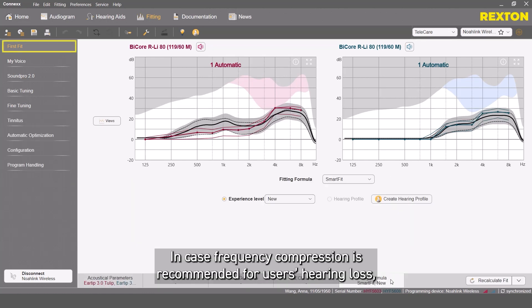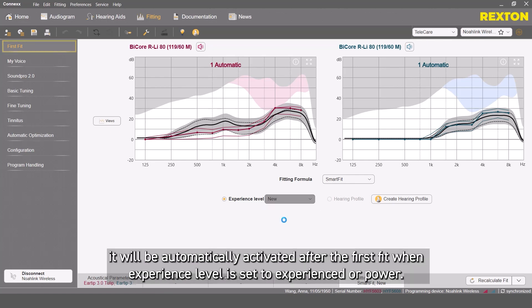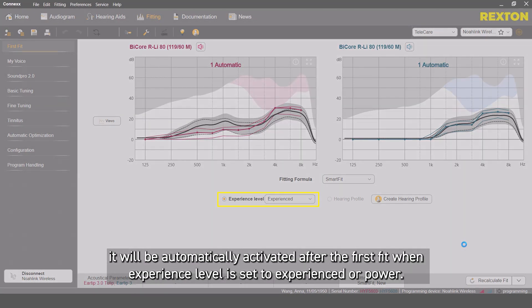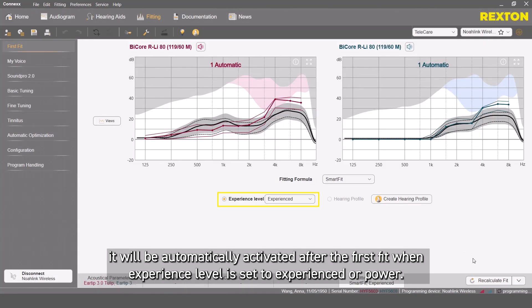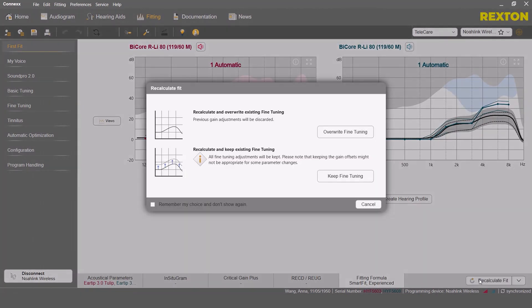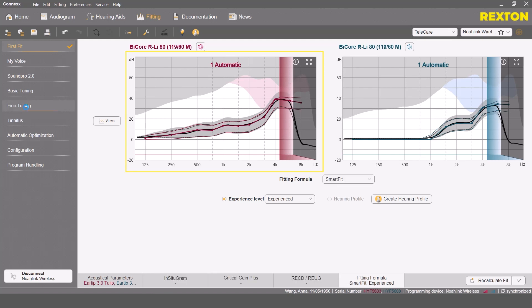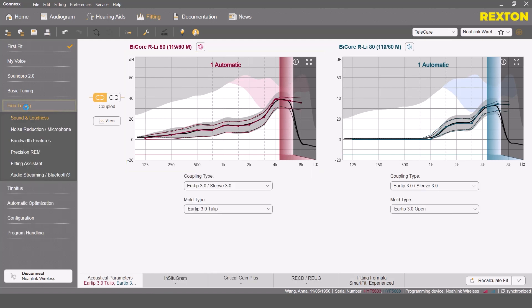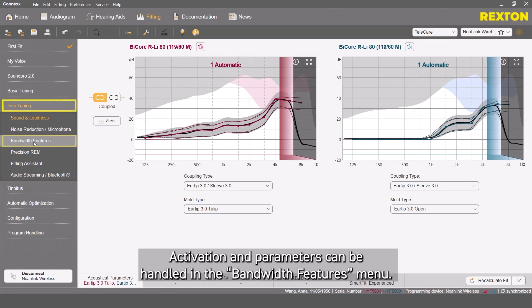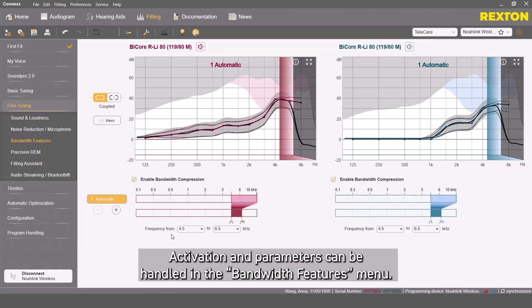In case frequency compression is recommended for the user's hearing loss, it will automatically be activated after the first fit when the experience level is set to experienced or power. This is how the curve looks when frequency compression is active. Activation and parameters can be handled in the Bandwidth Features menu.